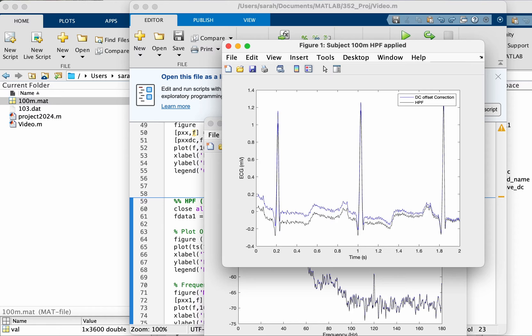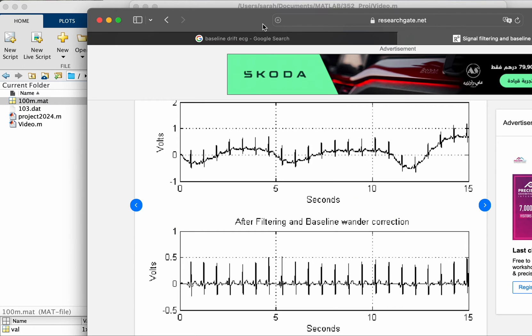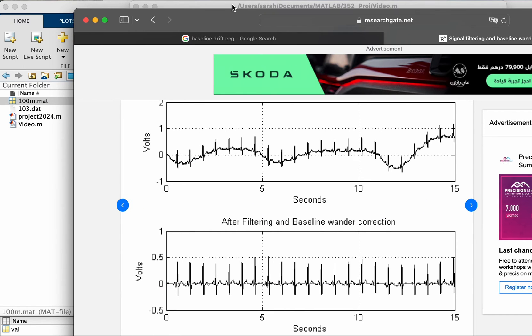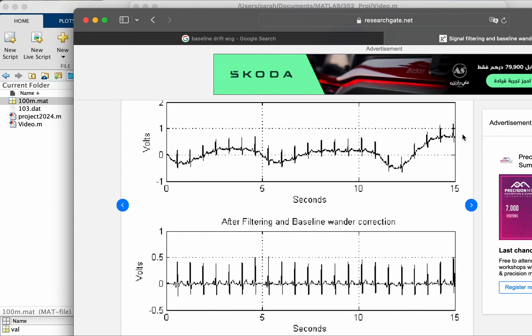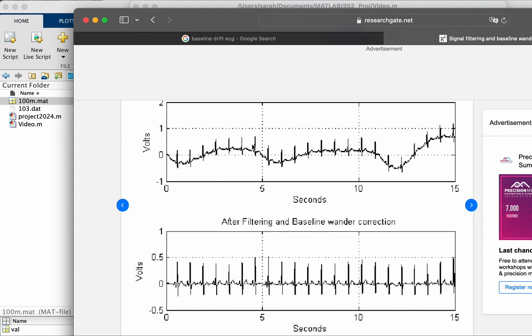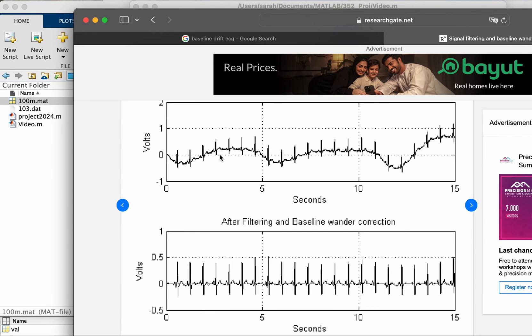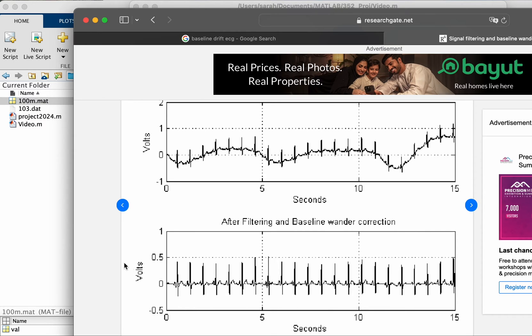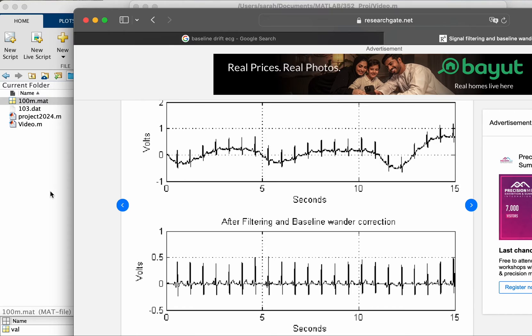You can see it clearly. So what is baseline drift? Let me actually show you a picture here. Baseline drift is when your ECG signal has a low frequency component that makes it go like this, and this is after correction. In our case, our signal was not that bad when it comes to baseline drift or baseline wander.